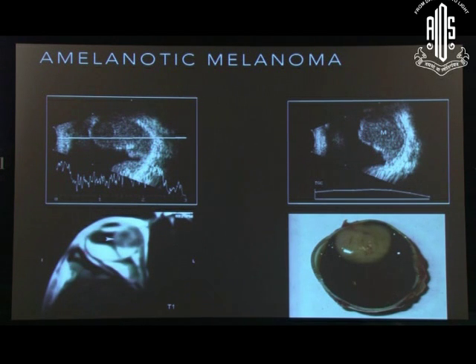And this is the MRI of the patient. It's an 8-year-old, and what's your diagnosis? Anyone? This boy had an amelanotic melanoma of the choroid. So surprises can always come. If you see something like a choroidal detachment, don't always assume it's only a choroidal detachment. Look further. You see this. This is what raised the suspicion. Suddenly a homogeneous structure within the heterogeneous lesion, indicating that this was bleeding from a tumor.